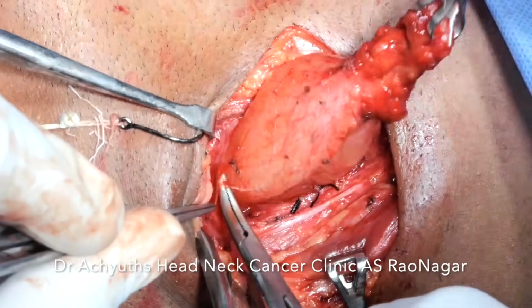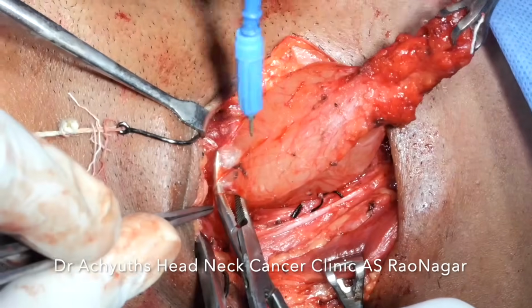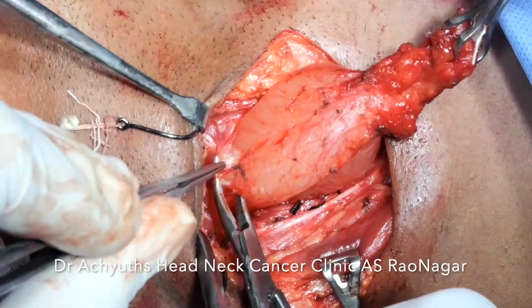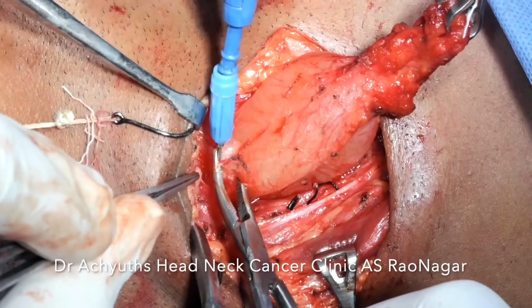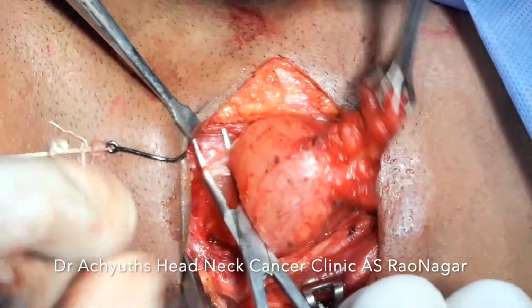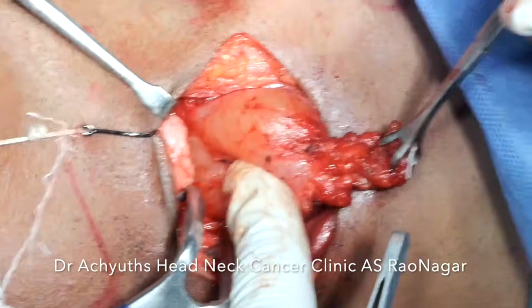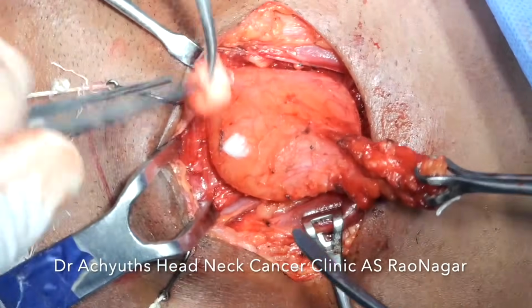You can nicely identify the differentiation between the cyst wall and the muscle. So I usually tell the assistant to cut it on the far away prong. Here it was the superior prong of the mosquito forceps, so that we don't overshoot and hit the wall of the cyst.